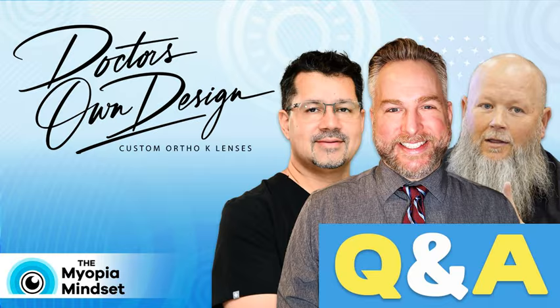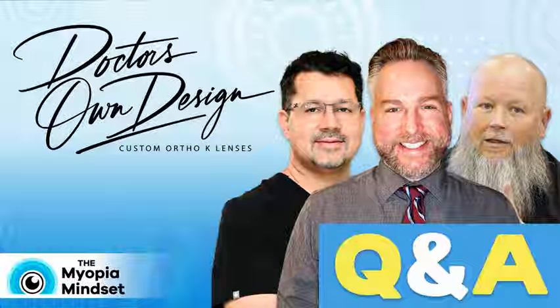So you spend a lot of time with a consultant, which is great because you learn a ton. And this is how Mark and I became such good friends, because I was on the phone with him all the time. Yeah. And so that's the one way. The alternative to that was to get a design software that is commercially available, and you sit there and you tweak every little curve, trying to get it just right to suit your patient. So that's really the two options I had.